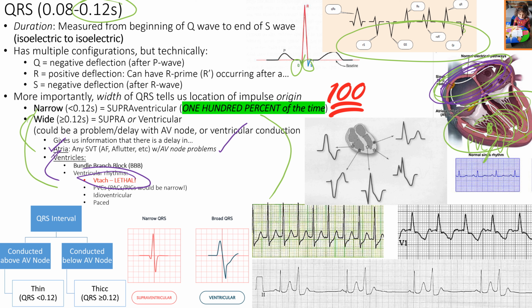Right. My next thing is to, again, notify the provider. But next thing is, well, shoot, what's the magnesium level? Because my QT is prolonged. What medications might they be getting because the QT is prolonged? Or if the PR interval is prolonged, what medications might they be getting?